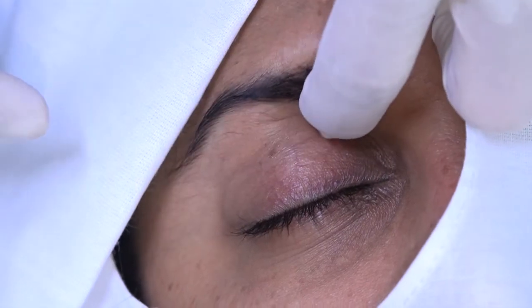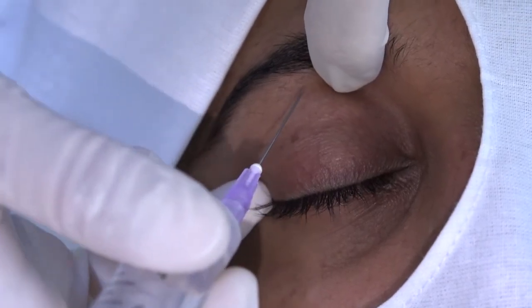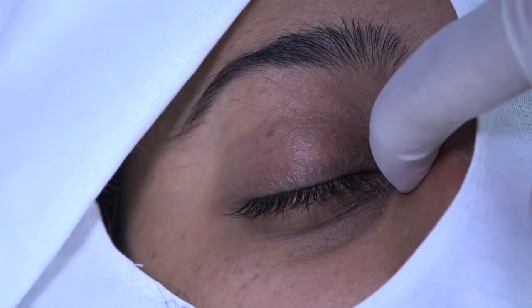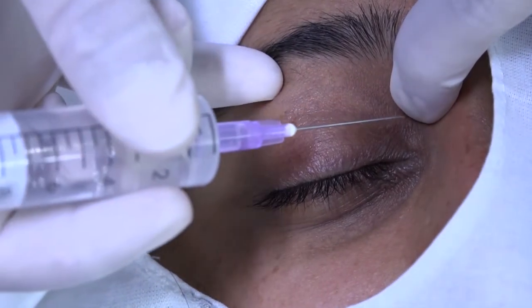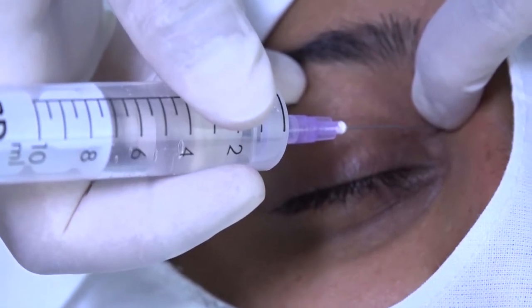For giving a supratrochlear block, the needle is inserted along the superomedial orbital wall just above the trochlea to a depth of 1.5 cm. To block the infratrochlear nerve, the needle is inserted below the trochlea just above the medial canthal ligament along the medial wall of the orbit to a depth of 1 cm.